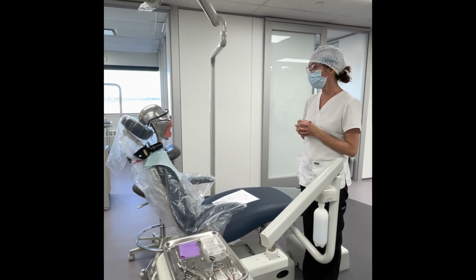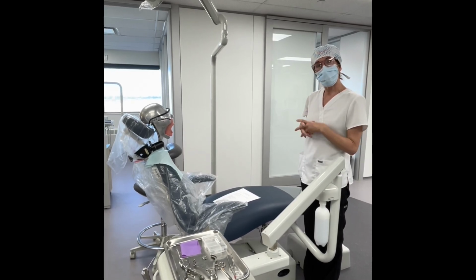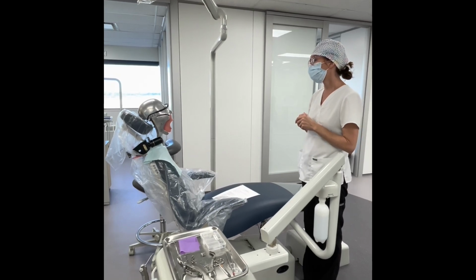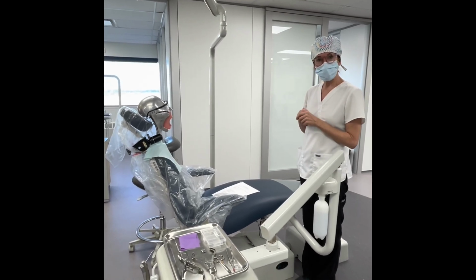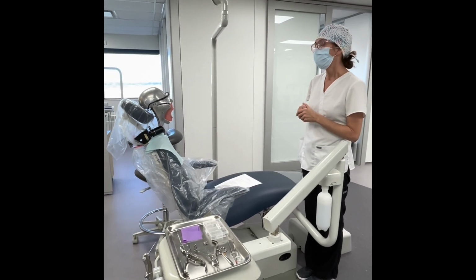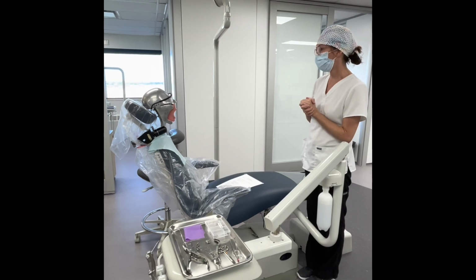Today we are going to be working on 2 teeth on the upper right. The tooth on the back right is going to be a silver filling, and then the tooth on the front is going to be a tooth colored filling. Today we will be using anesthetic or dental freezing. Have you ever had that before? No? Okay, well we just use it to make your appointment a lot more comfortable.